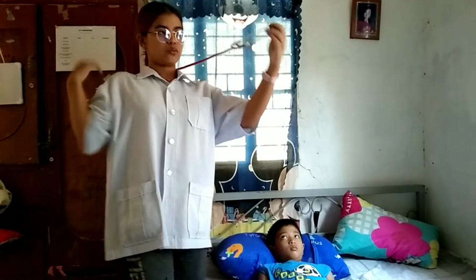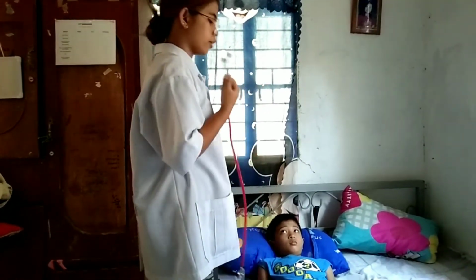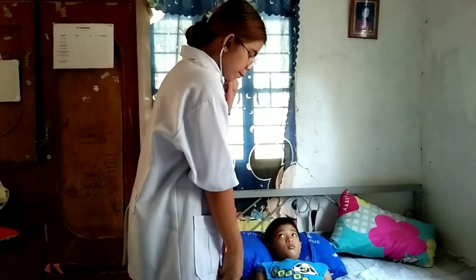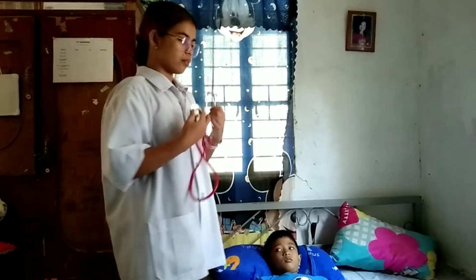After locating, we need a stethoscope to document the heart. We need to auscultate the apical part of the patient for 1 full minute.